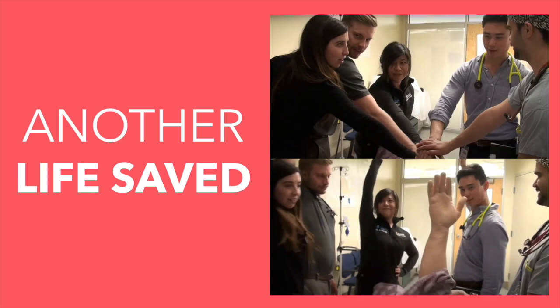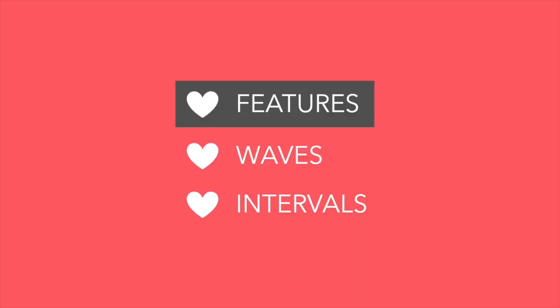Please do note that depending on which resource or textbook you read, you'll find that ECG diagnostic criteria and parameters differ slightly between resources. The numbers chosen in this workshop are ones that have consistency across several electronic clinical resources, as well as selected because of their ease to remember. Let's begin. First up is features.